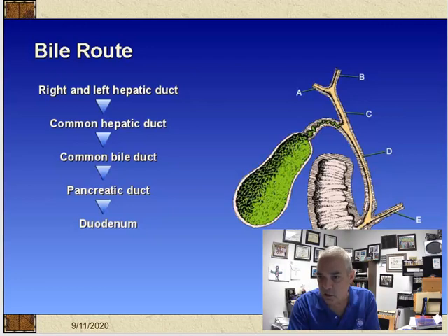Right here is where they normally place a stent, and it's just because for whatever reason the patient's sphincter is not opening, or there's some kind of a stricture there, some kind of blockage, scar tissue, whatever their malfunction is. But if there's a stent, then all that is just like a plastic tube, and it lets the bile just flow, relieves the pressure from the liver and from the gallbladder.